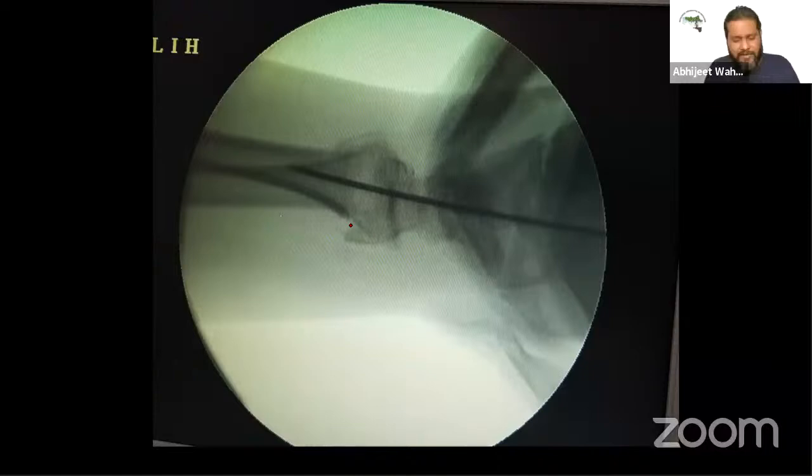from the clinical pictures, the amount of comminution, the fragment that was seen on the X-rays is being held in the forceps here. So there is metaphyseal comminution, which is causing the collapse and is rendering the fracture unstable. And it is a pretty distal fracture. And like Madam said, we address this fracture with a volar locking plate, and we retain that K wire for some time, and then we assess the DRUJ.